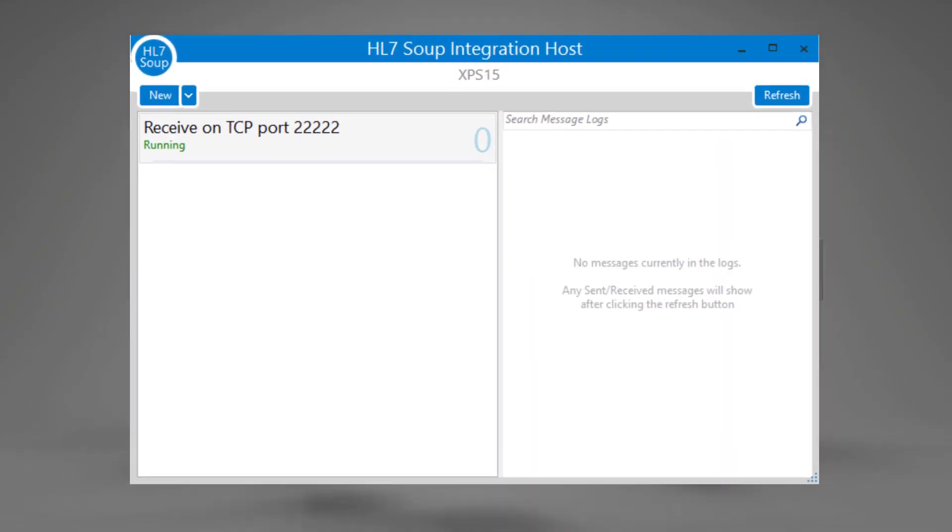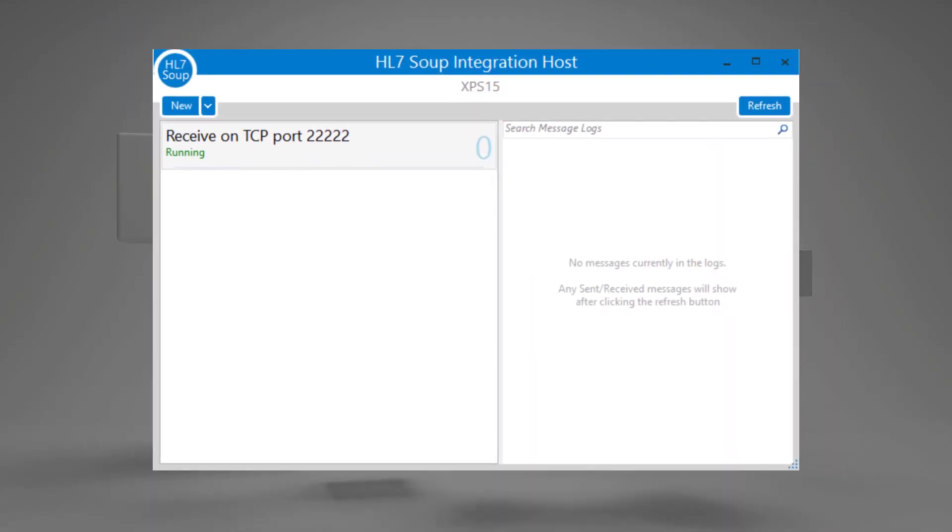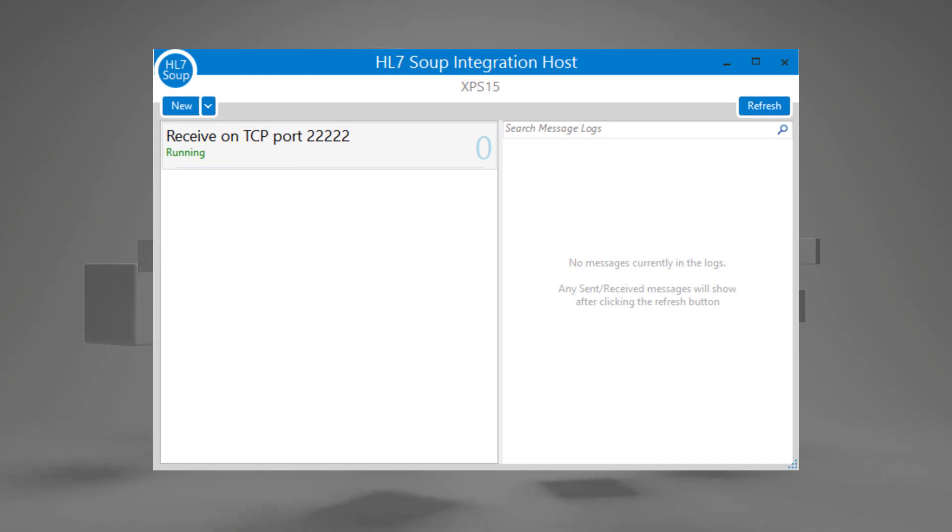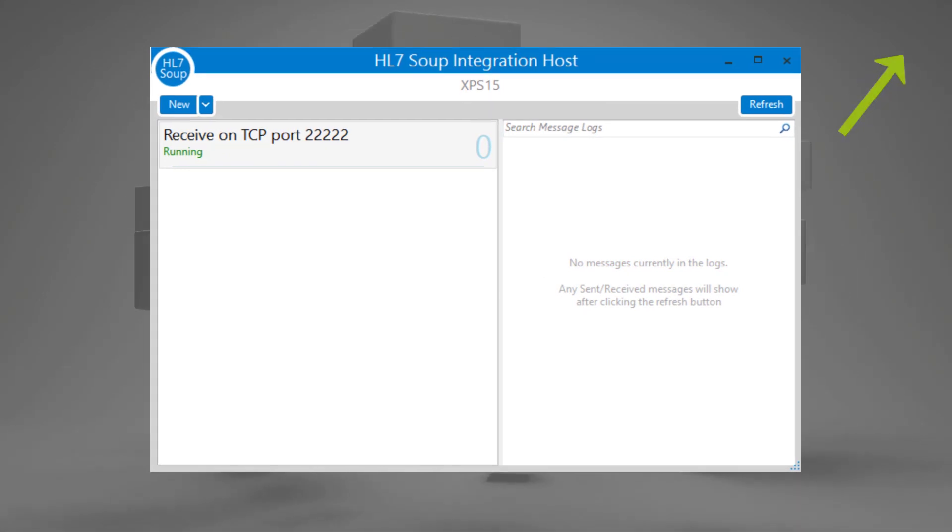Running the process will be HL7Soup's integration host. If you're new to it, we've got two getting started tutorials that'd be worth checking out after this video.